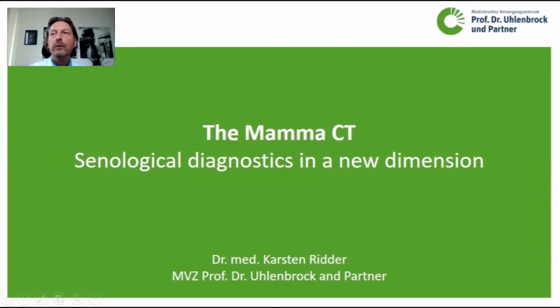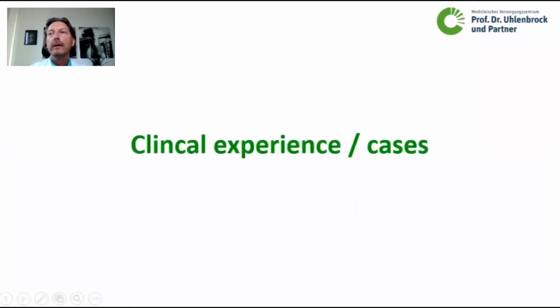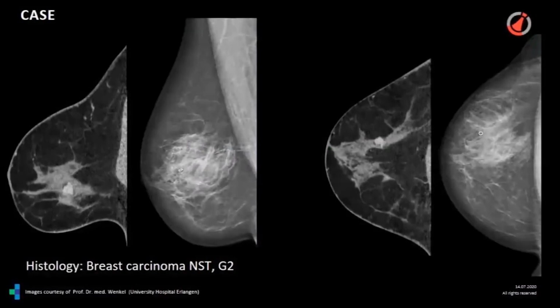In this talk I want to focus on the clinical experiences with this system and some really nice cases I can show you from the last weeks doing this modality. So what can we achieve? We can do MAMA-CT with contrast media.